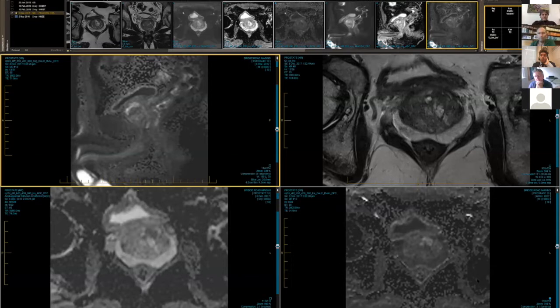So what happened here often is that PI-RADS 5 or PI-RADS 4, at the end, looking at them, it was not anything. So if we have any doubts, we prefer to repeat the MRI here and after, in case, go for fusion biopsy. And Francesco, were you finding that with the less experienced radiologists, a lot of the time PI-RADS 3 was getting reported as a bit of a sit-on-the-fence report, or not so much?